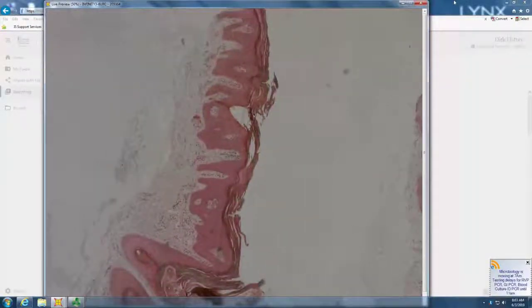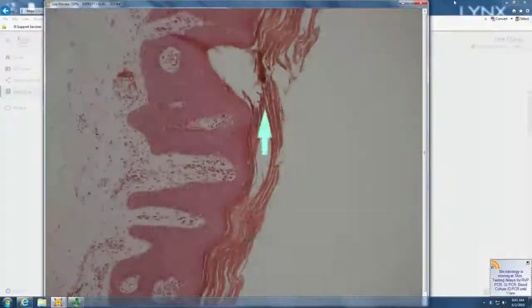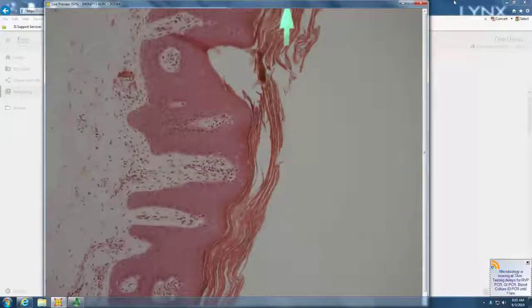But also, I think I'm seeing alternating orthokeratosis and parakeratosis, and it's kind of patchy, right? Almost in a checkerboard pattern, one might say. Yes. PRP. Very good. That's the PRP that is not platelet-rich plasma. That's the PRP that is pityriasis rubra pilaris.